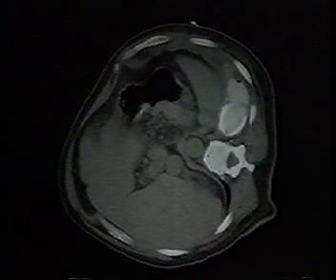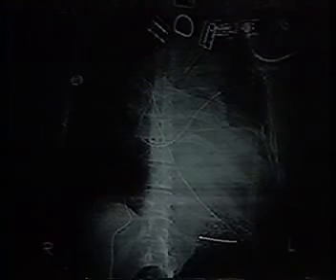This induced an increase in drainage from both catheters, and the patient was able to be discharged about 5 days after this procedure. So in this situation, it's important to realize that one might need to reposition catheters or place additional catheters when one has failed with the initial attempt to drain infected collections percutaneously.